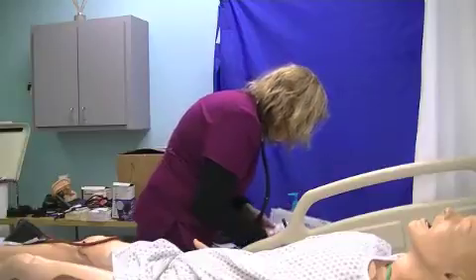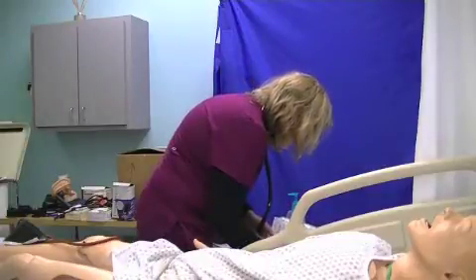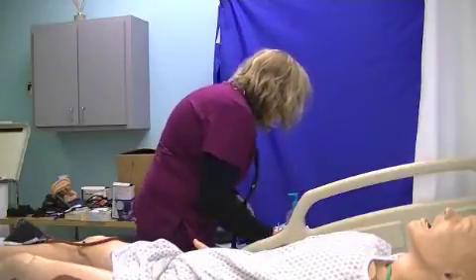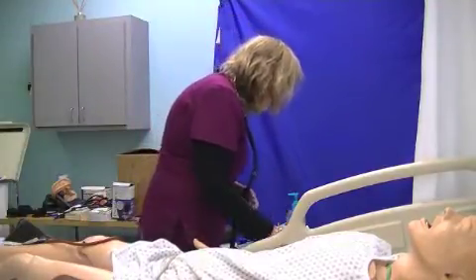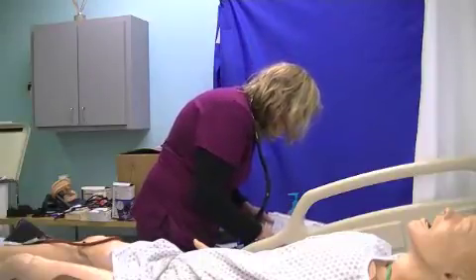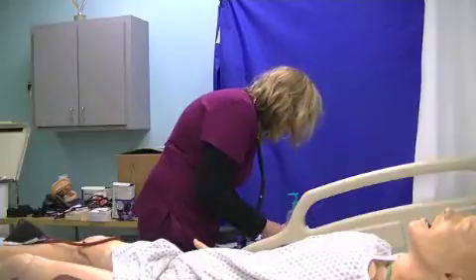So I'm going to write in my blood pressure, and it was 110/60. I'm going to write it like a fraction, systolic over diastolic. Mr. Pierce, your blood pressure is in normal range. We try to keep you between about 120/80 or less. I see your last blood pressure, I'm checking your baseline. It looked like you were around 120/80, so that's a pretty good reading.